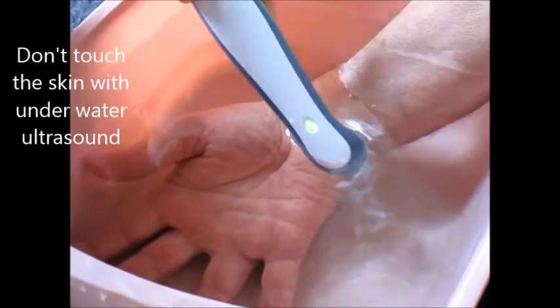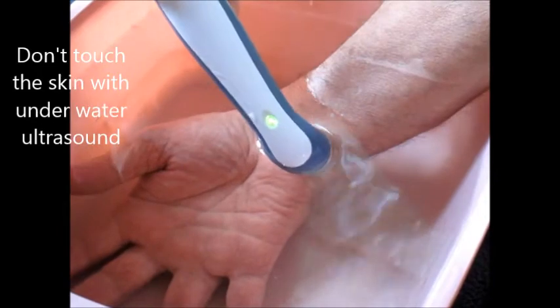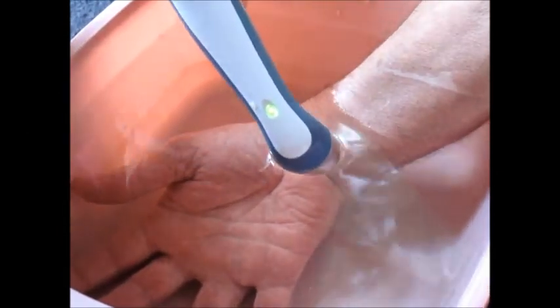You want to just move it in such a way that you don't stay in any one spot too long. He's not going to usually feel pulsed ultrasound, but I'm going to bring it up, and if you feel anything, just say that's enough.